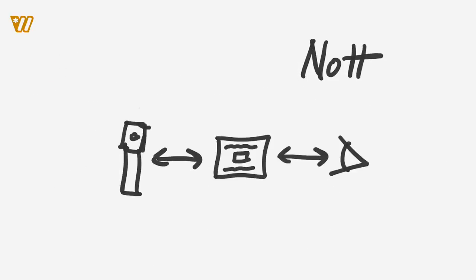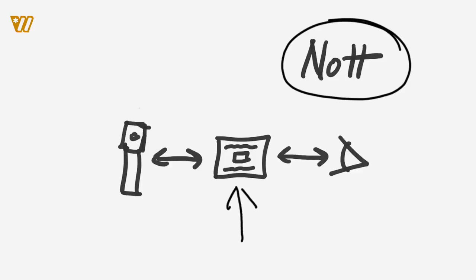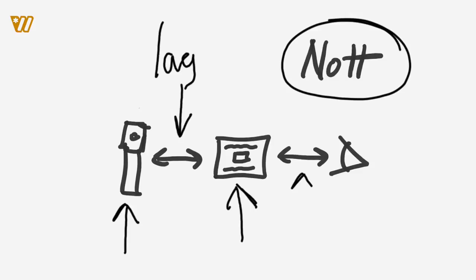Another dynamic retinoscopy method we want to talk about is Nott's method of retinoscopy, all right? In this case, the patient's going to be looking at a demand card. They're going to be reading the letters off that demand card or shapes. And what you're going to do is move your retinoscope, right, in and out to get neutrality, right? So if you find neutrality behind the demand card, you're going to be getting a lag in accommodation, right? If you find neutrality in front of the demand card, that's going to be giving you a lead in accommodation, right?